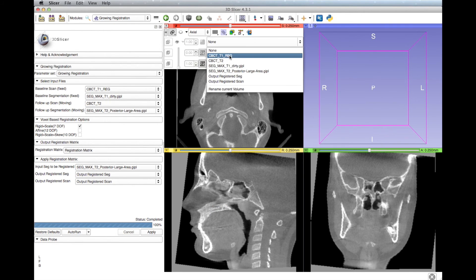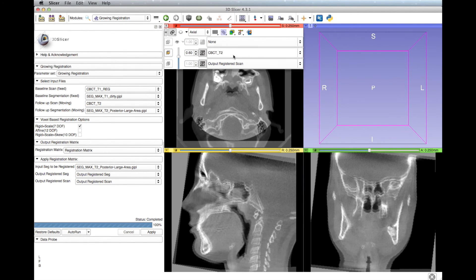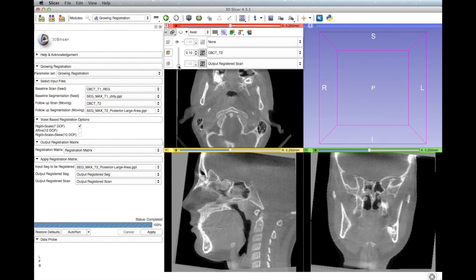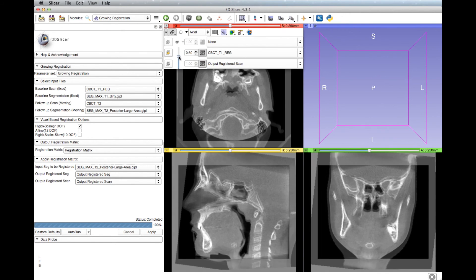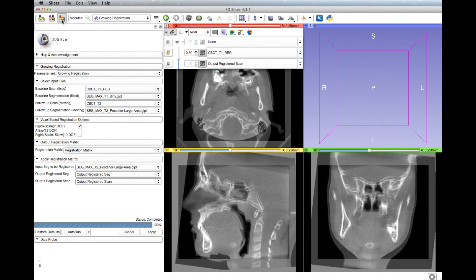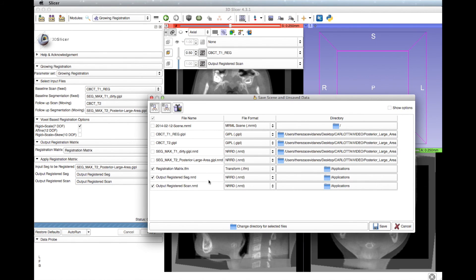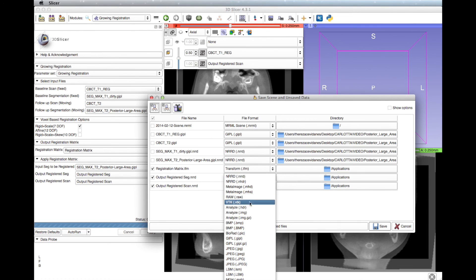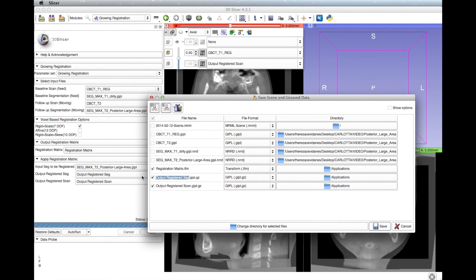Select the scans and move the crossfade bar up and down to change the transparency. Don't forget to save the files by clicking the save button at the upper left corner. Save the output registered scan, output registered segmentation, and registration matrix. If needed, change the file names, formats, and directories.